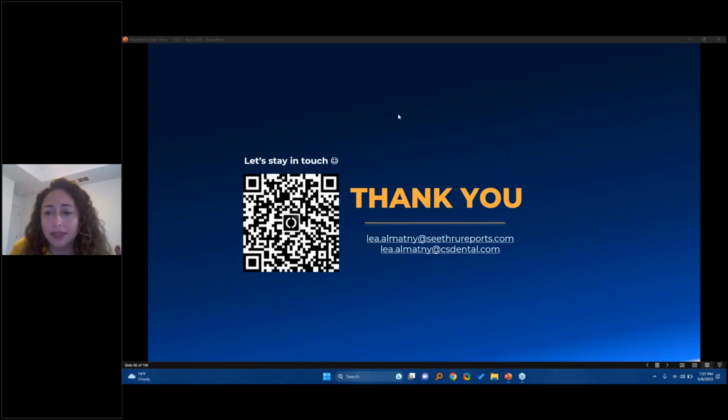You can contact any radiologist, if you already know one or closely work with one. If the tooth is vital, you see something around tooth number 19 and you're not sure if it should be treated or not, yes, I would recommend you contact a radiologist and share the CBCT scan with them. If you already have someone you work with, then that's good.